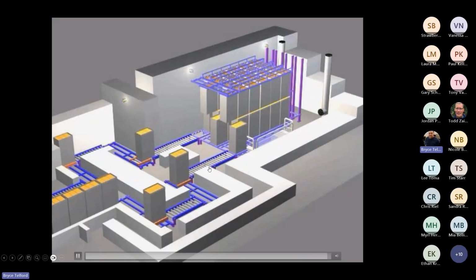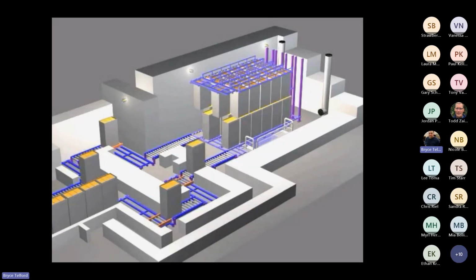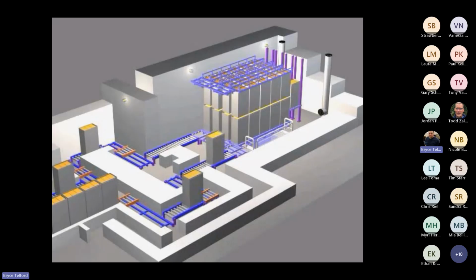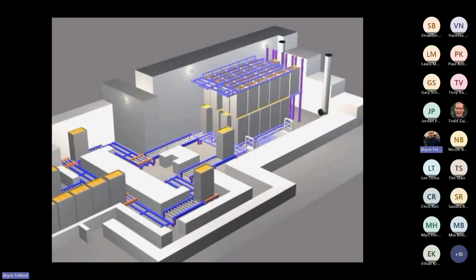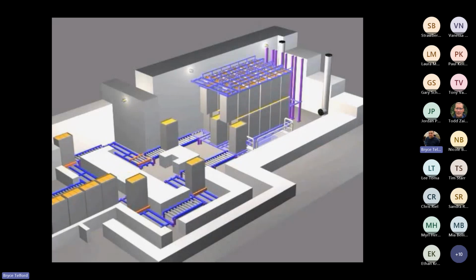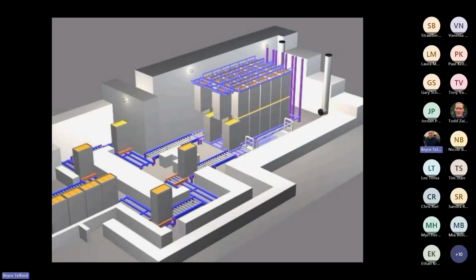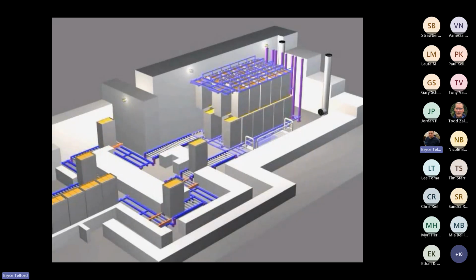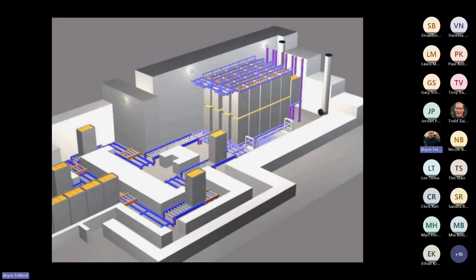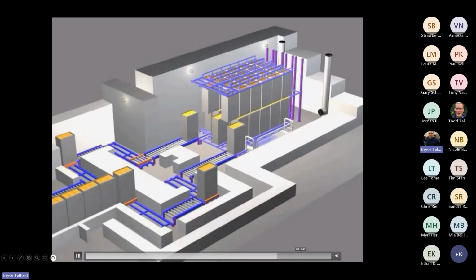If I have a product that has a very large dose range, let's say, for example, 20 to 50 kilogray, I have extra room that I can fit into more cycle options. The more cycle options I can fit into, the more cycles are available to my product. Likely, the faster my product is going to be able to be processed through that irradiator, and that's going to improve my turnaround time. So we want to give the irradiator some of that flexibility, if possible, in order to be able to fit into some of those additional cycle options.